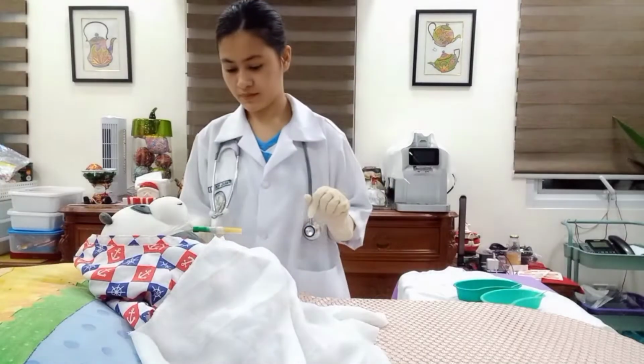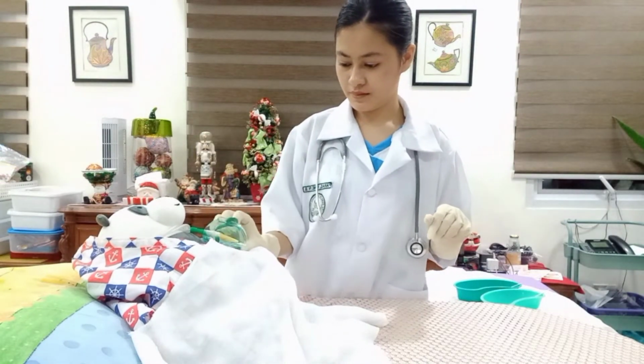Next is attach the oxygen source to the outer cannula. So this is to prevent oxygen desaturations in the patients during the procedures. So next is care for the inner cannula. Pick the reusable inner cannula from the container of hydrogen peroxide and scrub it with the sterile nylon brush. So this is to be used with your dominant hand. So the rationale of this is to cleanse the inner cannula of secretions.